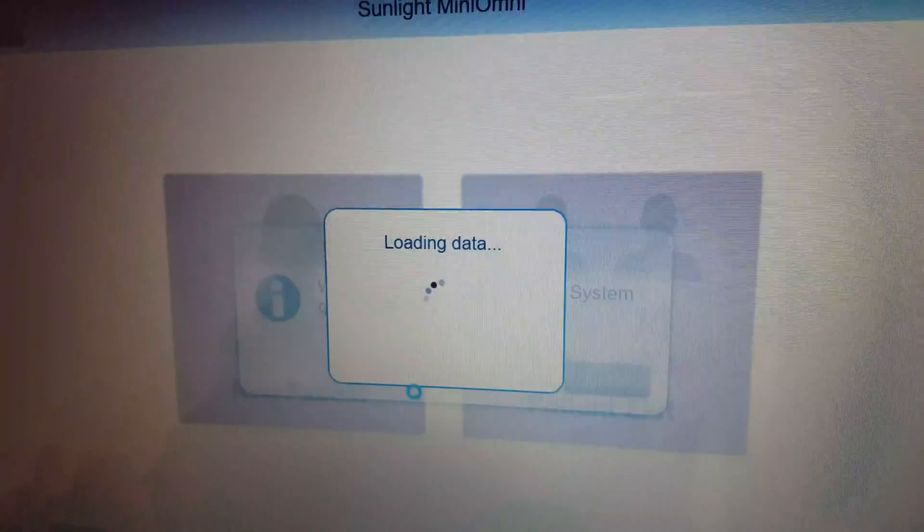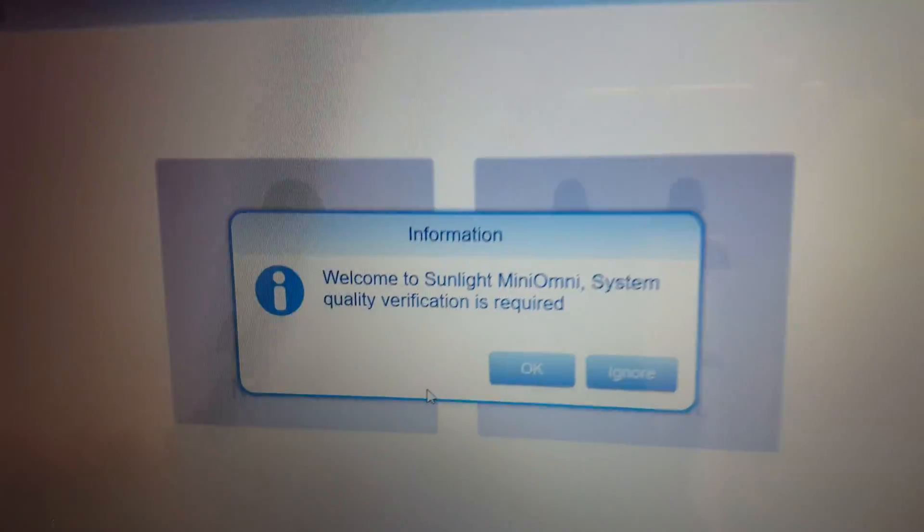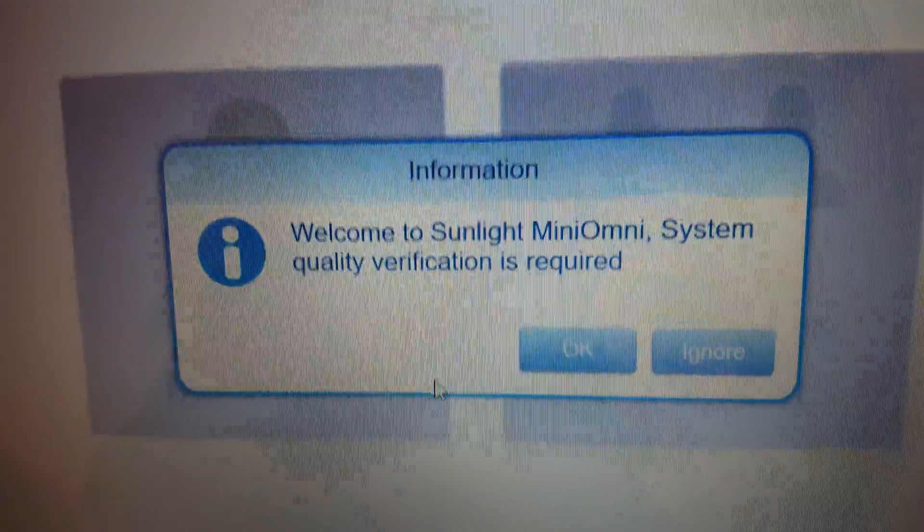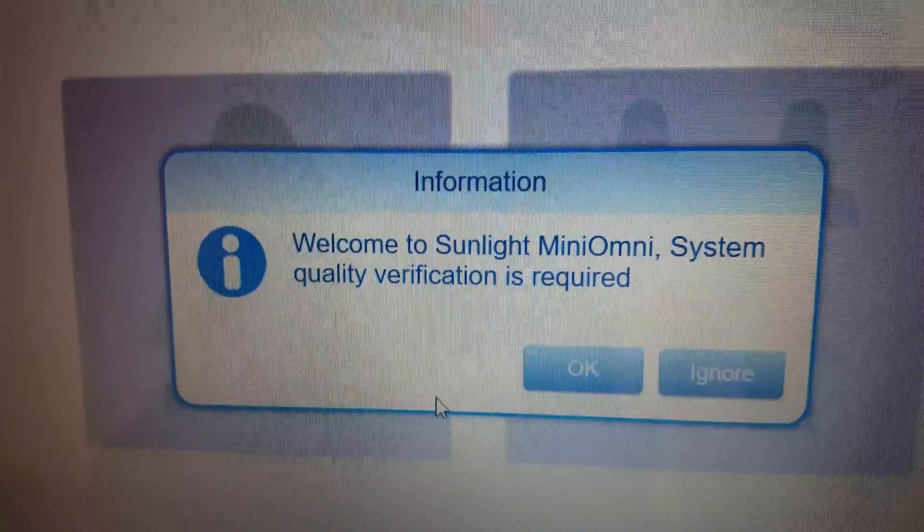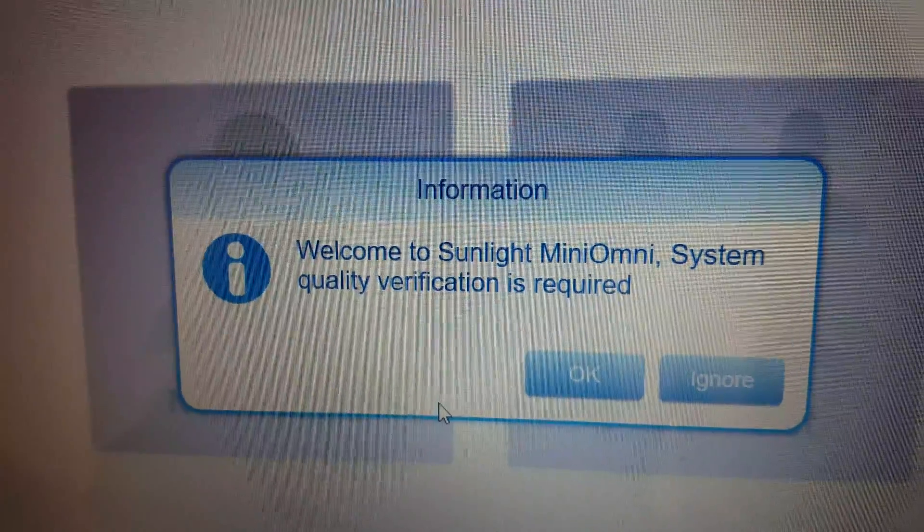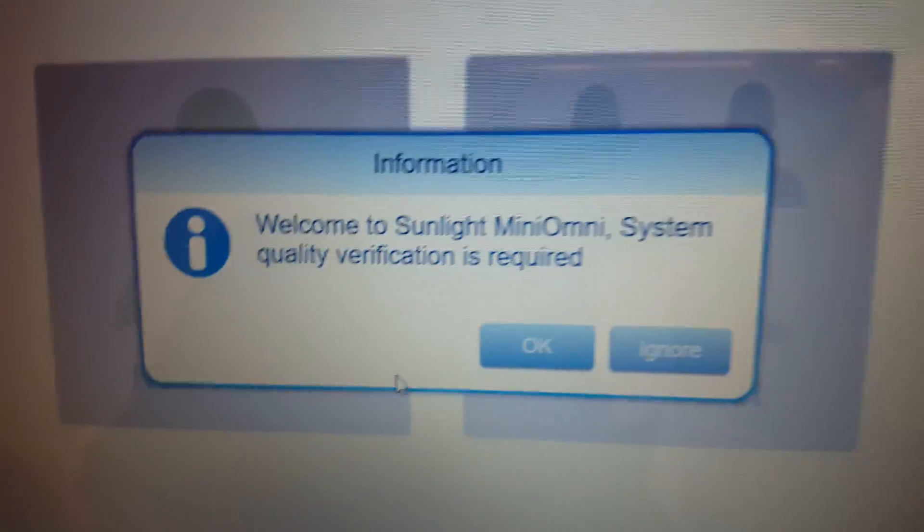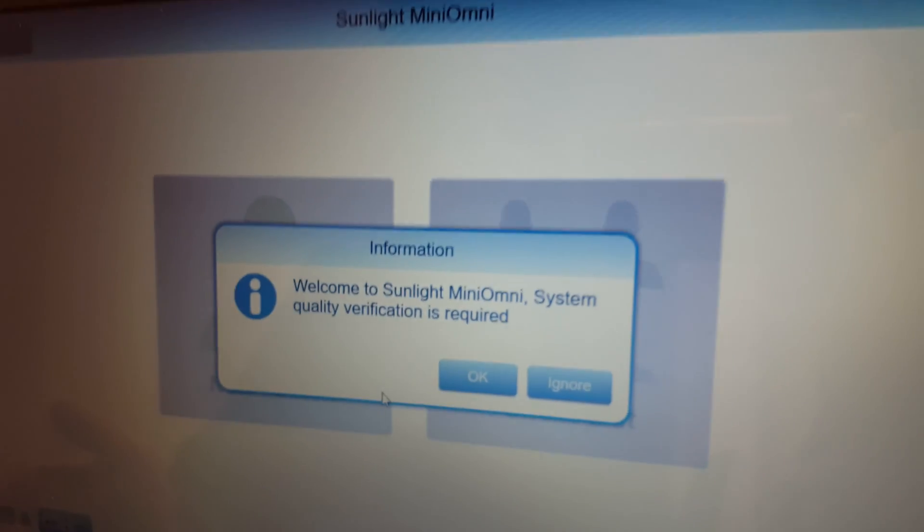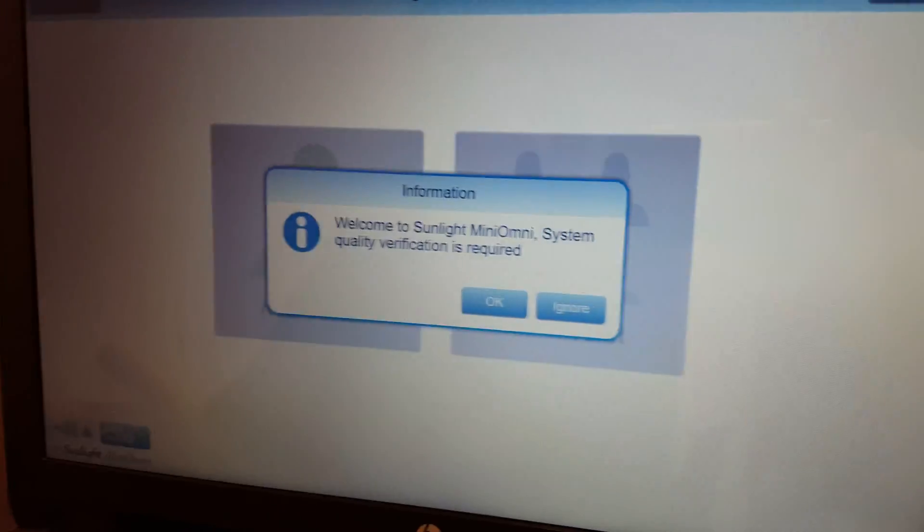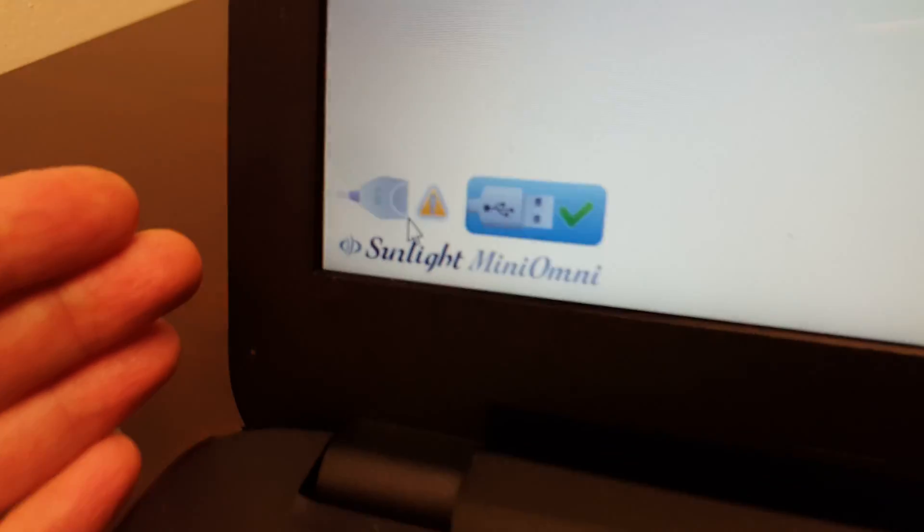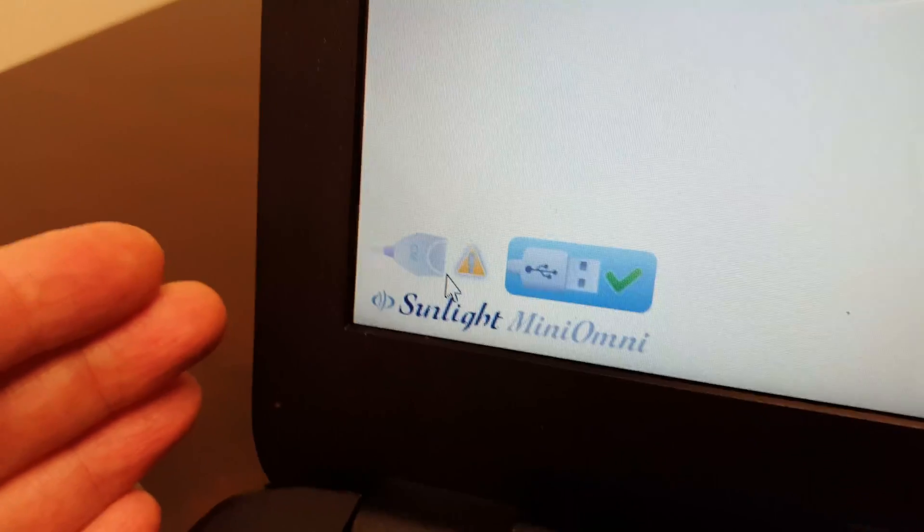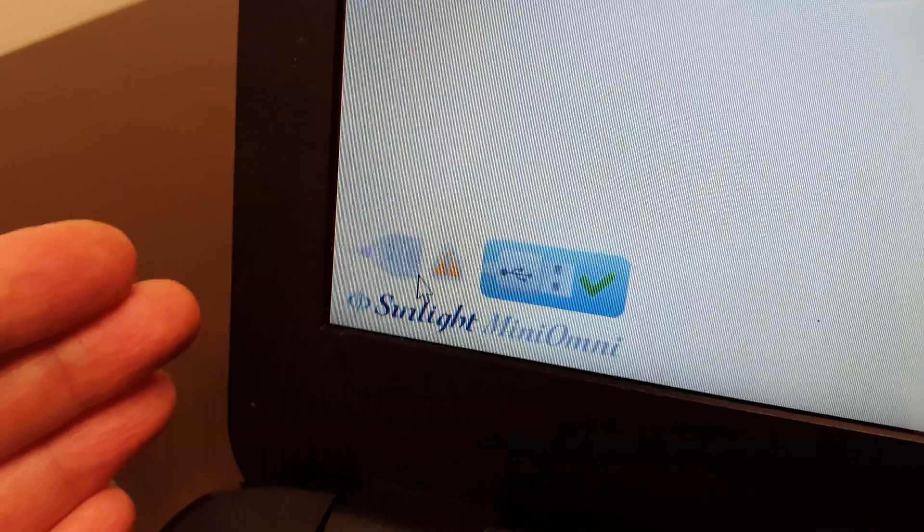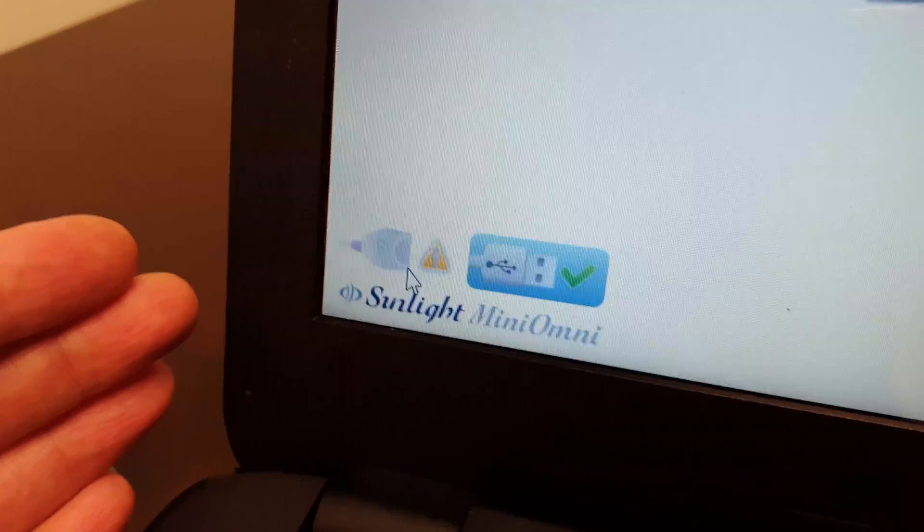Click on login, and before you begin scanning patients that day, you'll see the welcome screen indicating quality verification is required. You'll also notice the yellow triangle at the bottom with the probe, saying that you must check your probe.